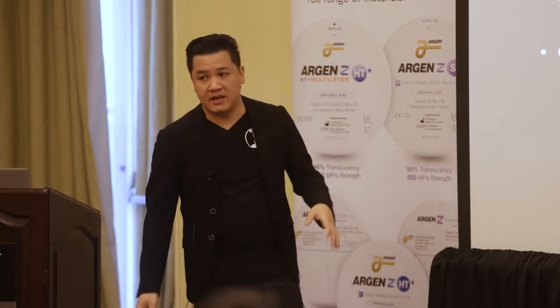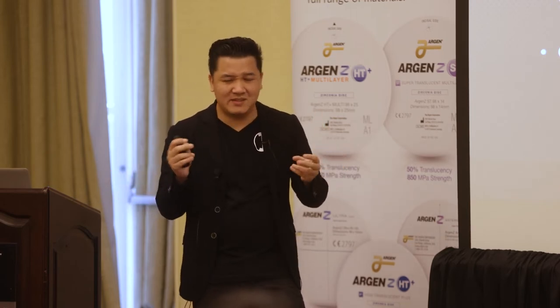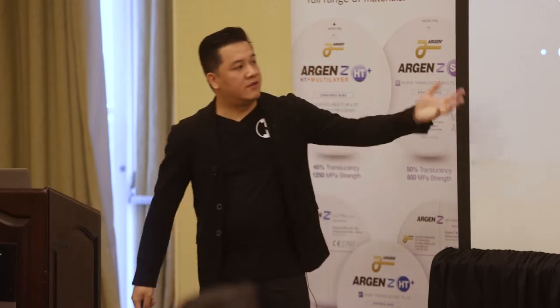So you can create all these different mock-ups. You can do 5 different diagnostics, triangular shape, rectangular shape, whatever you want. Could you imagine sitting at the bench, waxing things up, 5 diagnostics by hand and delivering them? Absolutely not. It's absolutely insane. But I could do this with, I'm not going to say it's super, super easy, but with very little effort. And then you deliver these to the doctor.